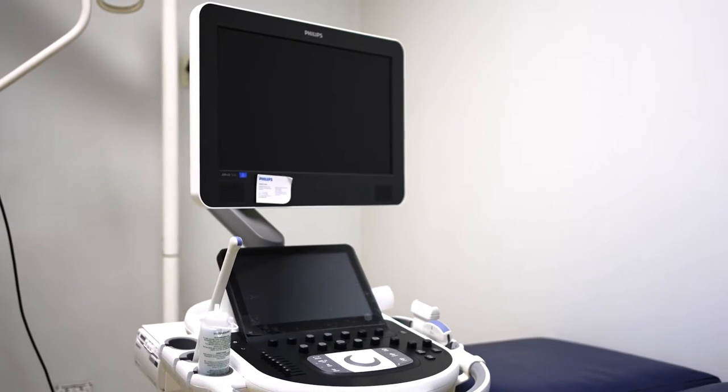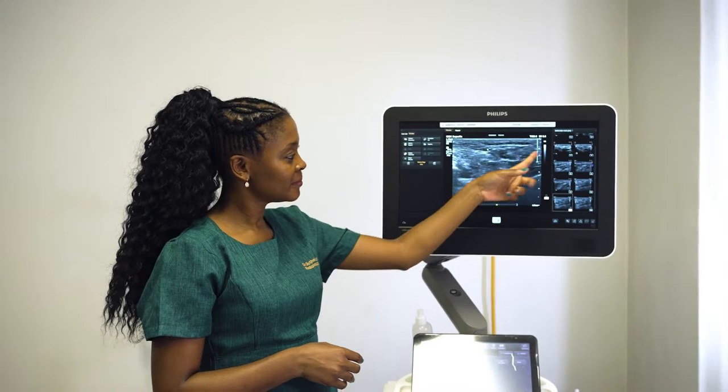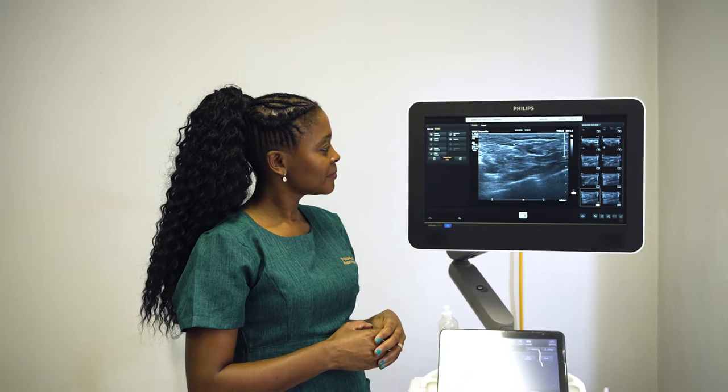My name is Dr. Tandi Butilezi, and I am a radiologist. This video will describe the procedure of obtaining an ultrasound-guided fine needle aspiration of the lymph nodes of the armpit in this study.